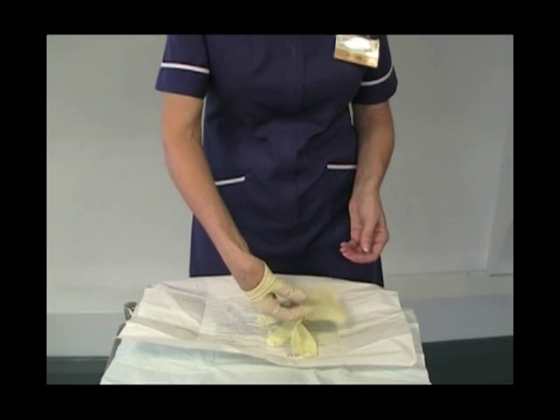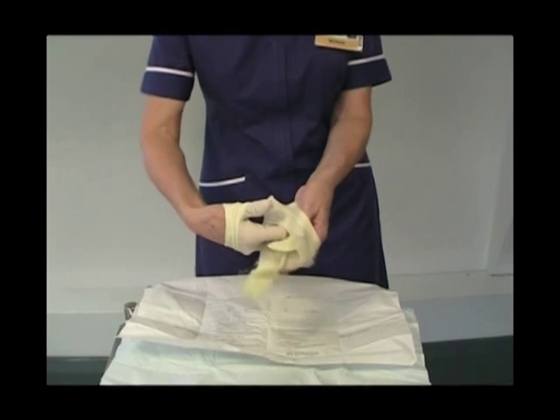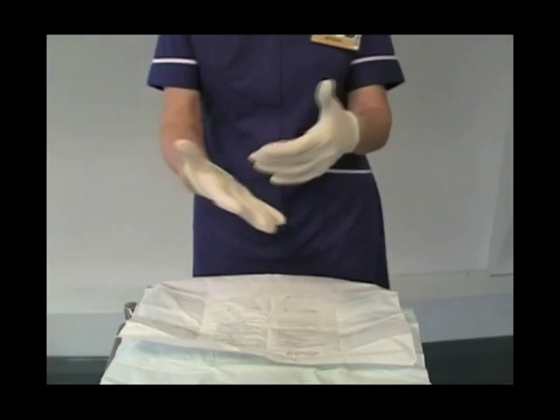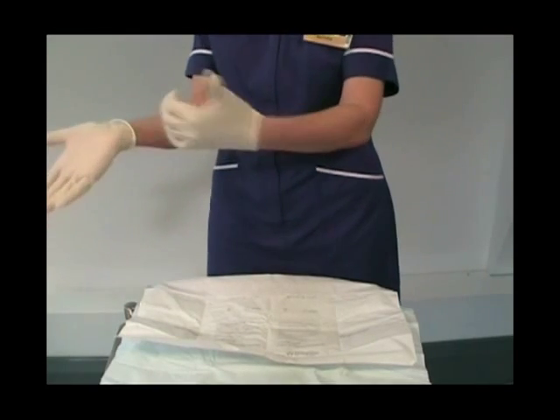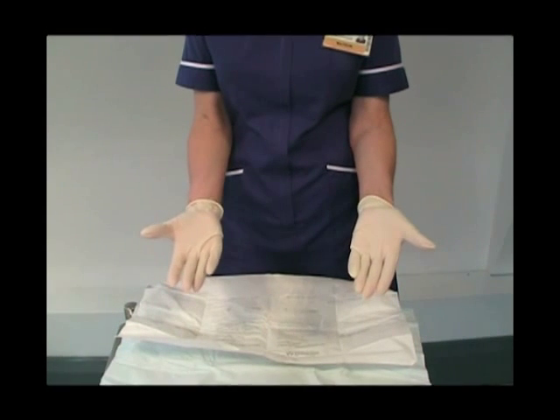Place your fingers in the cuff of the left hand glove and put your fingers in. You can now adjust up over your hand, pulling it down over your fingers, and as you can see I've maintained the sterility.